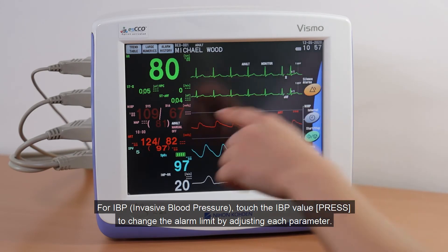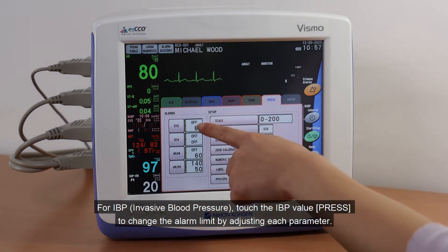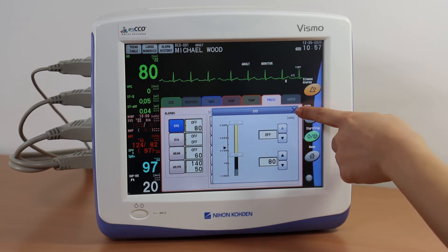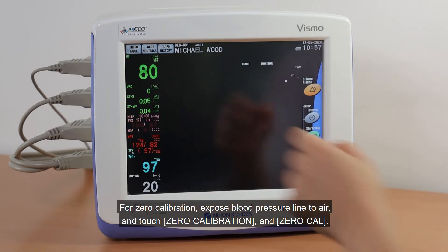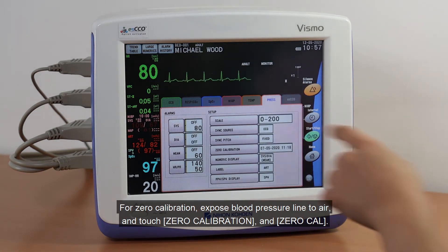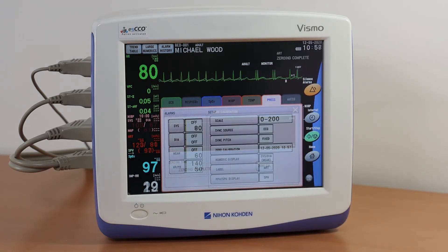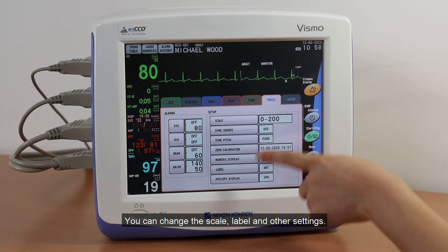For invasive blood pressure, touch the IBP value to change the alarm limit by adjusting each parameter. For Zero Calibration, expose the blood pressure line to the air and touch Zero Calibration and Zero Cal. You can change the Scale, Label, and other settings.